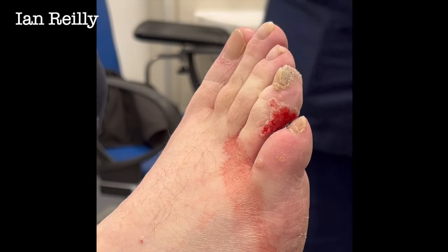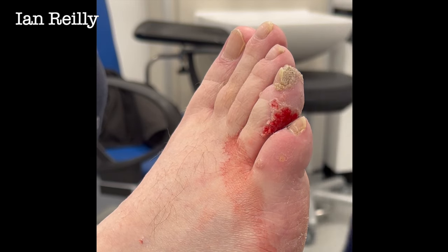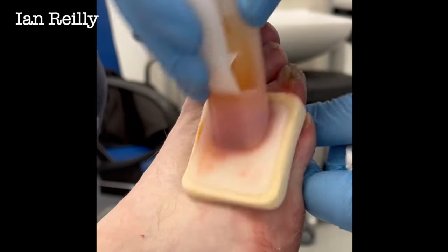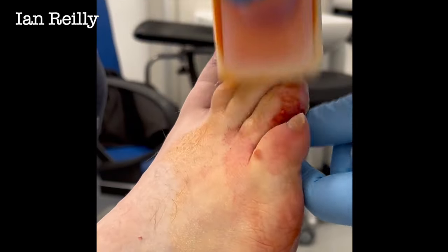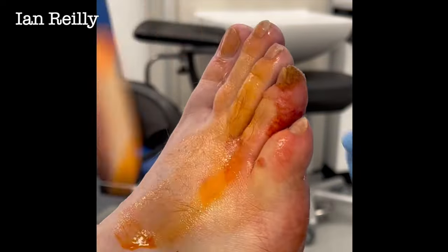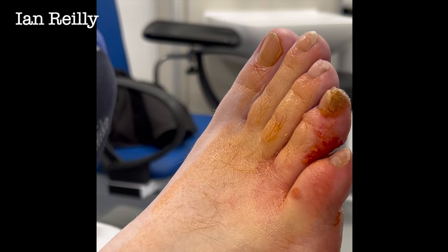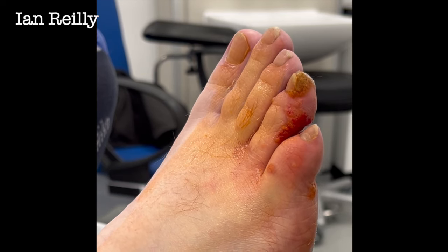One of the things we get with the pathology of a verruca is all of this pinpoint bleeding, and that's almost a sign that it is a verruca. The reason you get these little blood vessels — technically called papillomatosis — is that the blood vessels go a bit nuts and grow in the skin. So you take the overlying callus off and it bleeds. If you've got a callus or a corn and you're not sure which is which, you give it a wee shave, and if you get pinpoint bleeding, it's more likely a verruca.